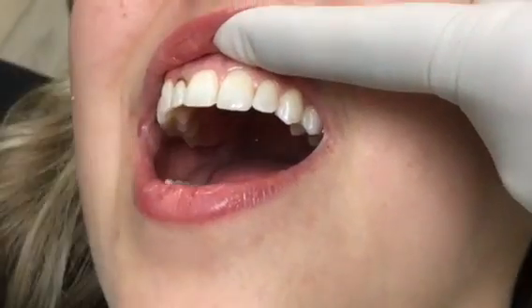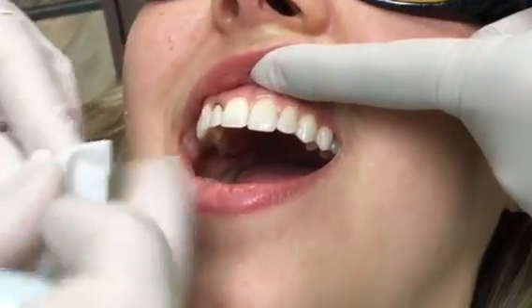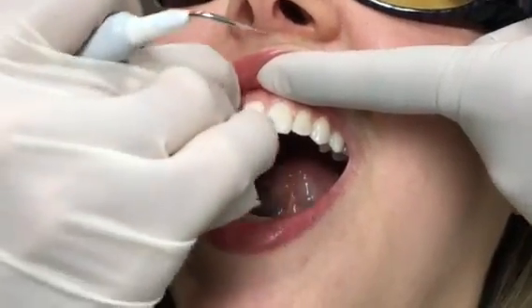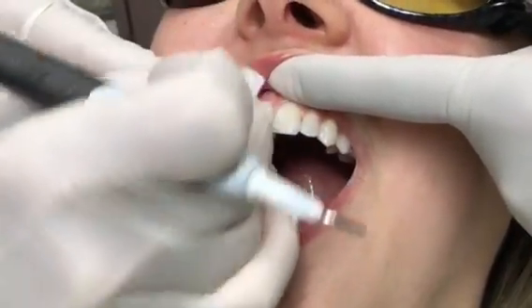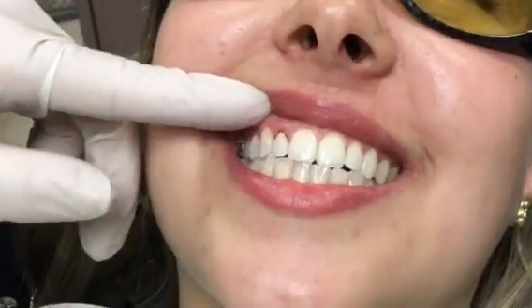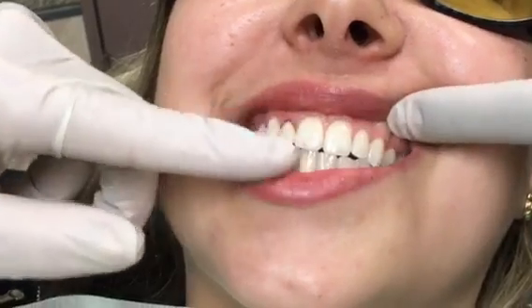So let's take a look. The patient may just smell a little bit of odor, but not really. Small, big — as you can see, we're getting there. So we're just going to do a little bit more.